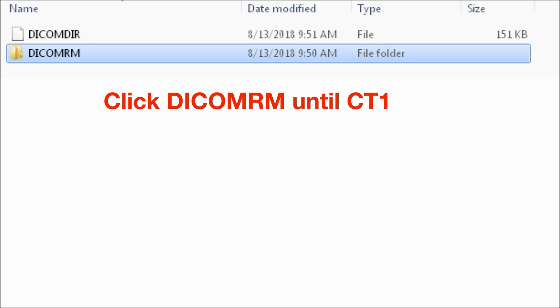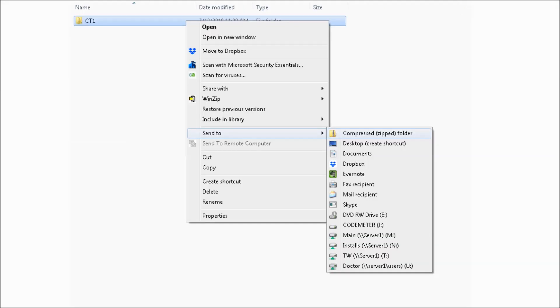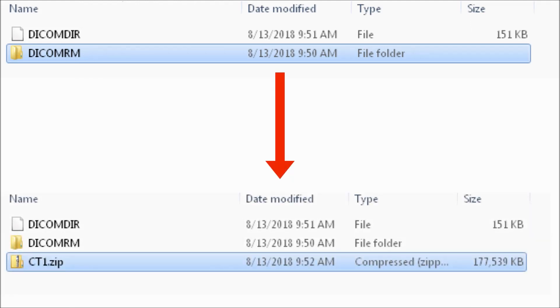Once you've exported your file, you're going to see a DICOM-RM folder, and you have two choices. If you want to save a couple of steps, you can just click on your DICOM-RM and zip or compress that file — though you'll have quite a large file that's going to take some time to upload to Azento. Another option would be to click into your DICOM-RM until you see a CT1 file, which is where the images are actually saved — it could be called CT3 if you chose something other than export to third-party manufacture. Once you see that CT1 file with all your images, just send it to a compressed or zip folder. That's all the data that you need to submit to Azento.